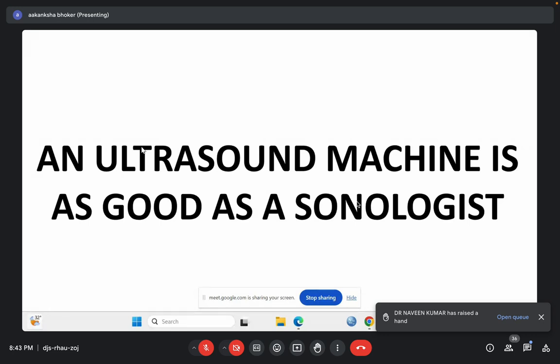Angle means you just there are different motions of ultrasound. In next lecture we will see what are different types of motions you can go with the transducer. आपने transducer एक organ के ऊपर रखा है, उसको थोड़ा left right कर दो तो angle बदल जाएगा. You can change the position, you can look for some other echo window. So this is the way you can change the angle.